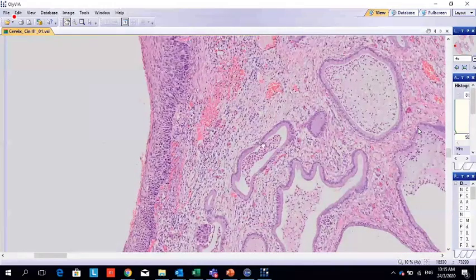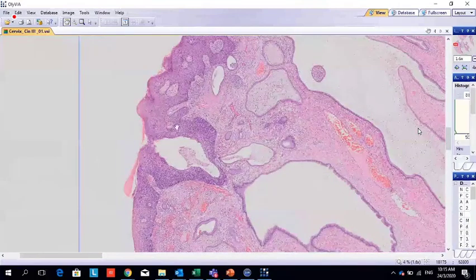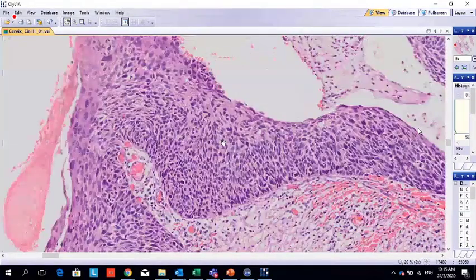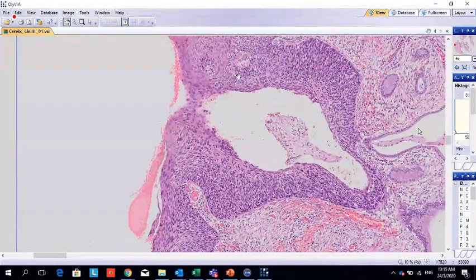And benign growth. Oh, it's not benign, actually it's the same. Okay, why this? Look at this. It's like gland, isn't it? This looks like gland, filled with malignant cells. Actually, this one, the CIN entry, you may think this is invasion. It's not invasion. Actually, it's extension of the CIN through the glands, the cervical glands.